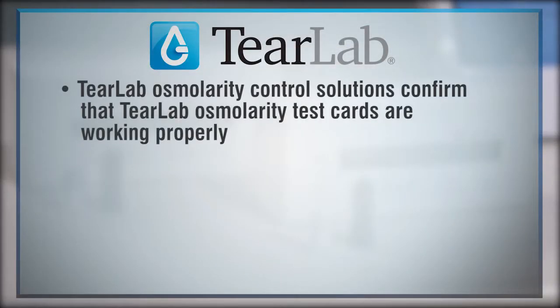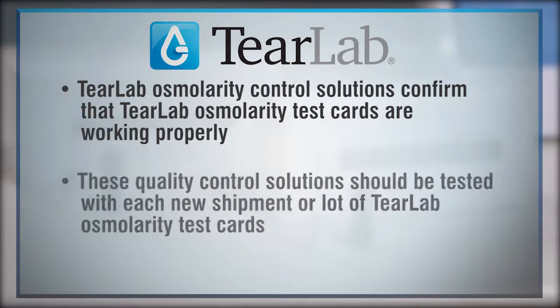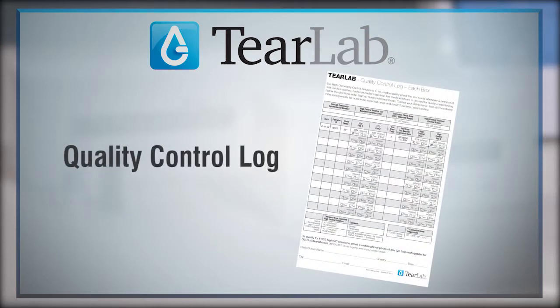TierLab Osmolarity Control Solutions confirm that TierLab Osmolarity test cards are working properly. These quality control solutions should be tested with each new shipment or lot of TierLab Osmolarity test cards, and results should be recorded in a quality control log.